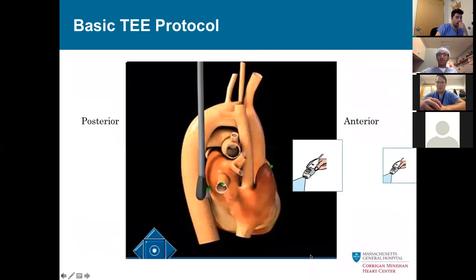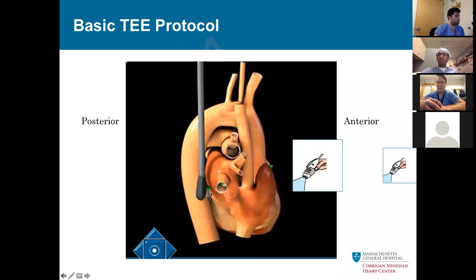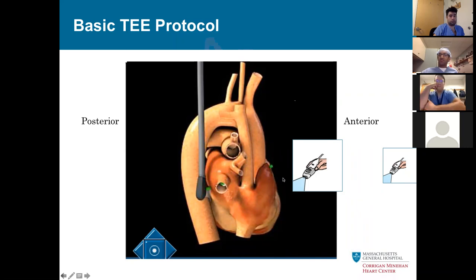As you start to think about the basic views, if you're only in the OR looking at TEEs or only looking at TTEs pre-op, you will recognize TEE views if you understand TTE and vice versa. The reason is that all images are mirror images of each other. The TEE probe goes down the esophagus so you're looking at the heart from behind. The top of the screen is always where your probe starts. With TTE you're coming around to the anterior part, and you may be starting far from the heart — even further with chest tubes — making the image pretty poor.